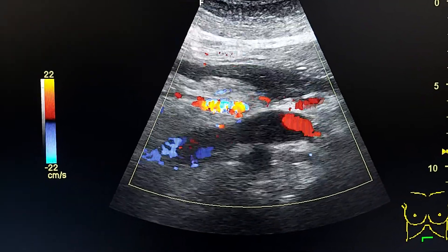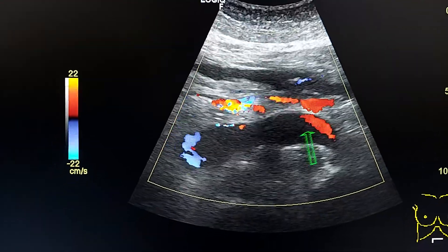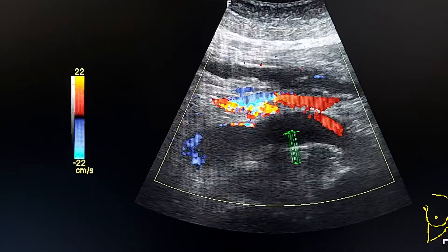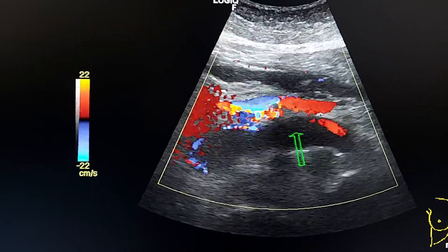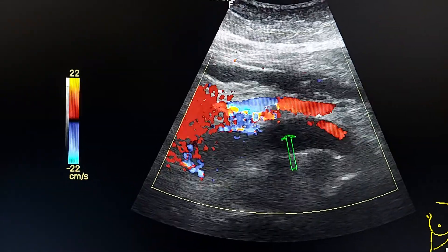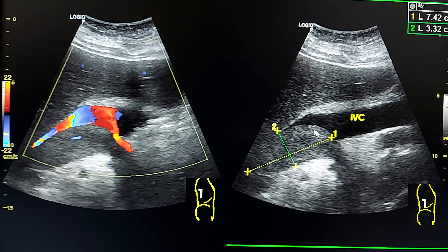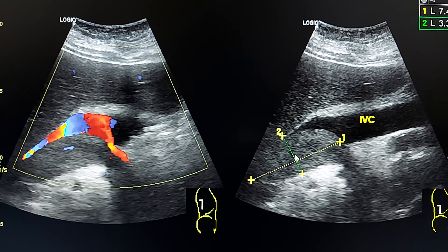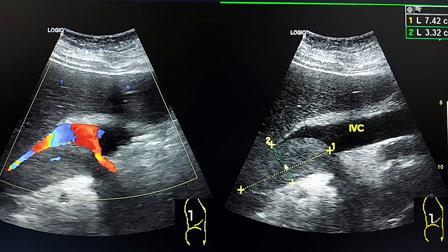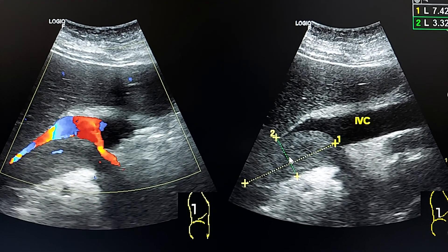This is the renal vein and this is the aorta. We see that there is a thrombus here because there is no flow across the lumen. Here in the IVC we see a wedge-shaped hyperechoic lesion extending into the IVC at the level of the renal veins.